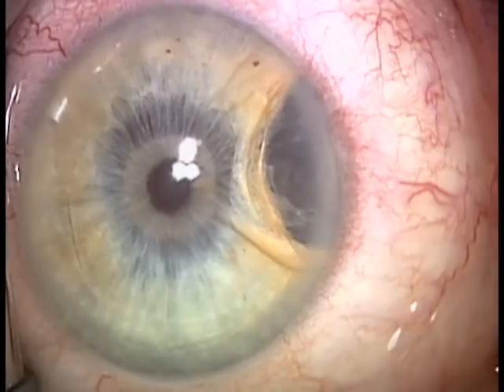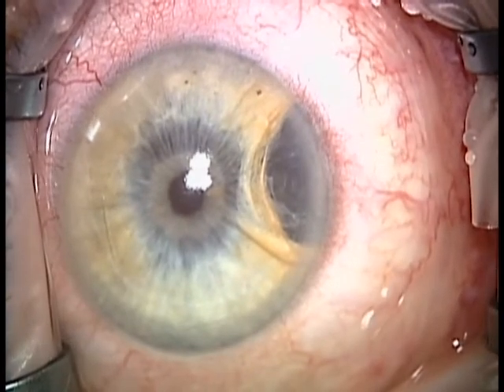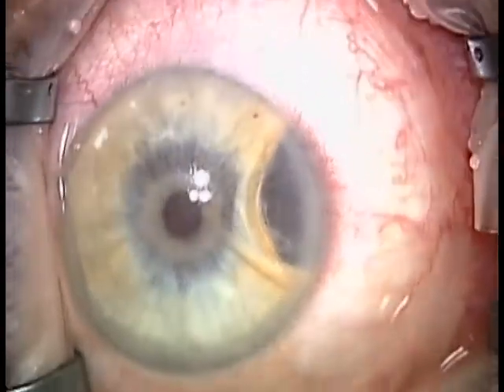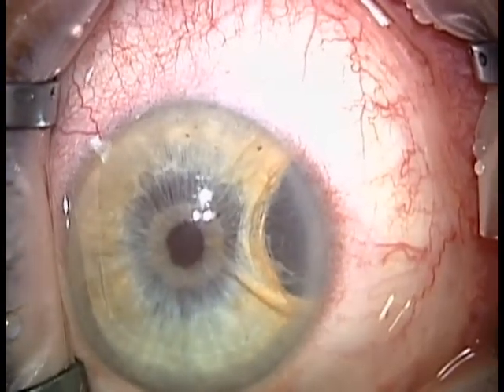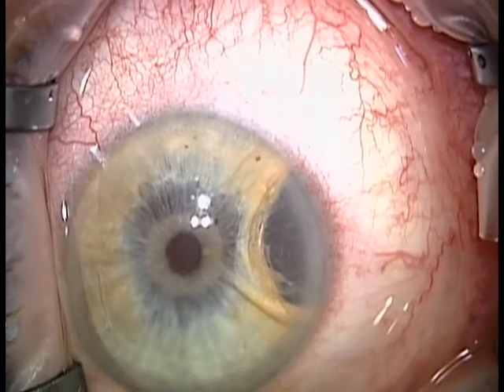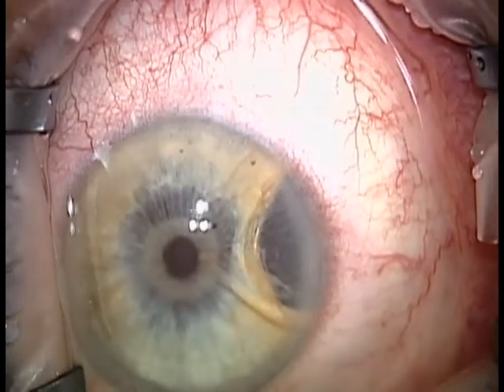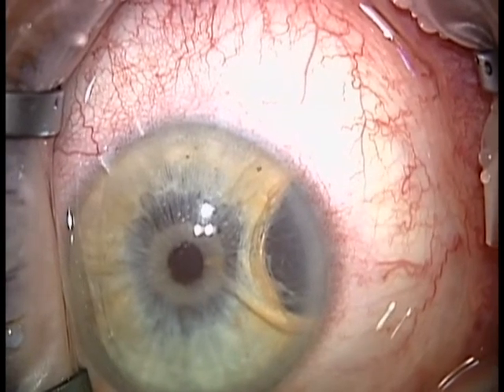This is a typical epithelial implantation cyst following cataract surgery. At some time during the procedure, epithelium was introduced into the iris stroma and a cyst formed. Management of these cysts can be done in a number of ways, but the method presented in this video is intracystic alcohol injection using ethanol.